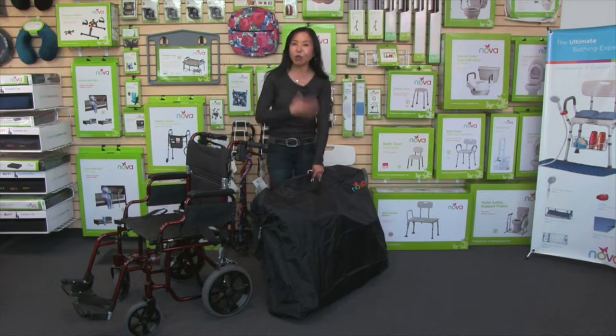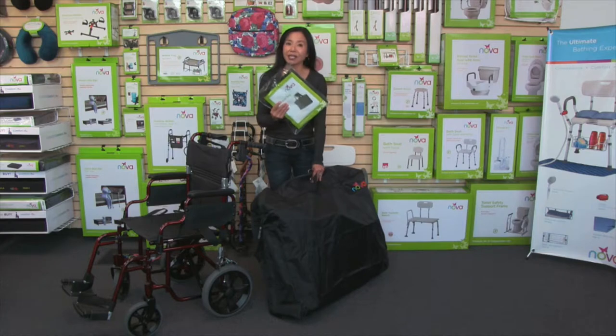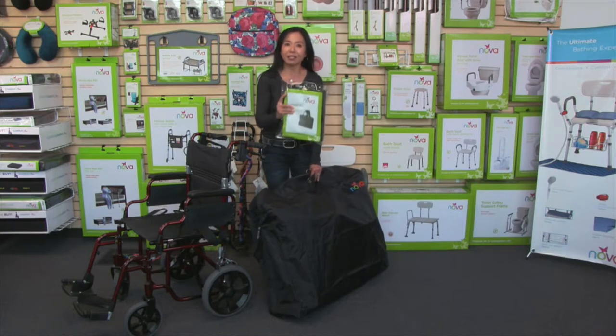It's compact, so once you're done using it, you can fold it up. It's going to arrive to you folded up, so you'll see how compact it is.